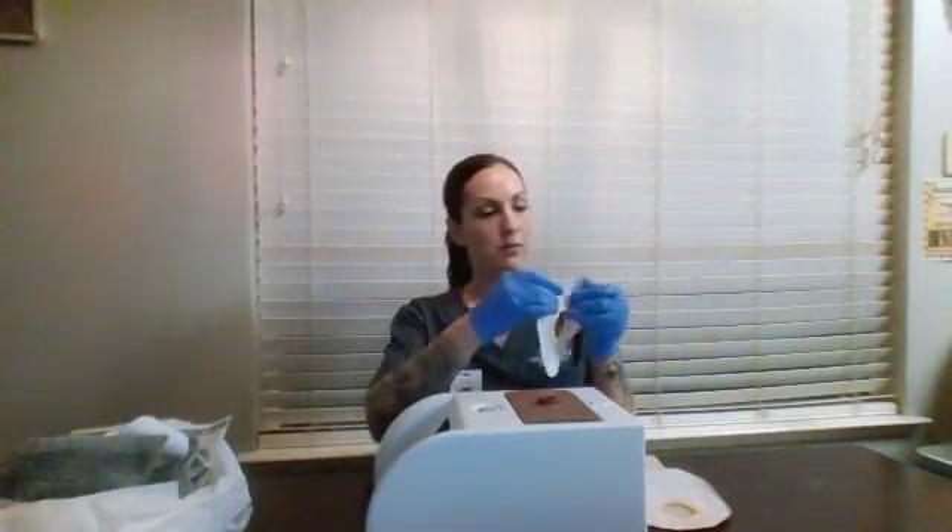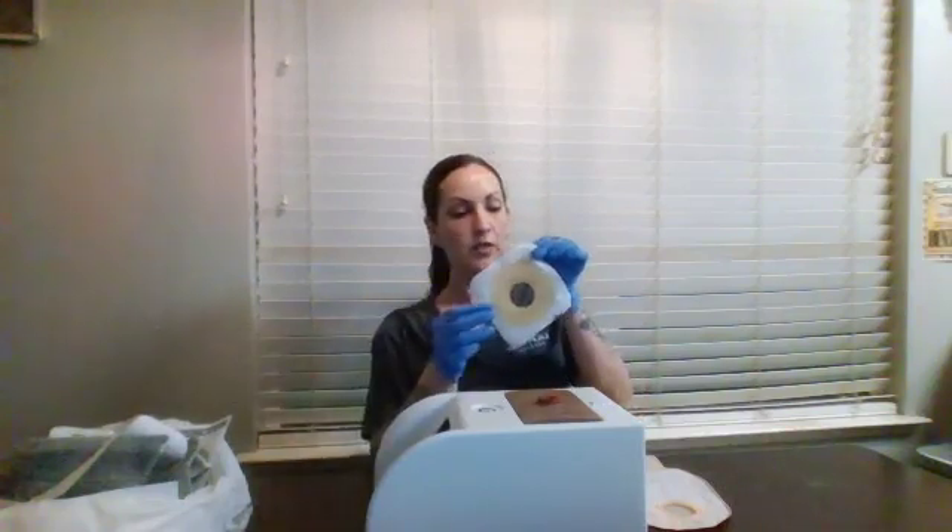Now we're going to apply a skin protectant to the stoma and to the surrounding skin, and allow that to dry completely. Next, we're going to take our face plate, remove the white backing, and put this directly over the stoma. Lay it flat, press down around, and ensure a good fit and seal so that there is no leakage.